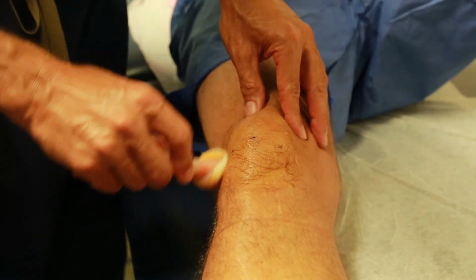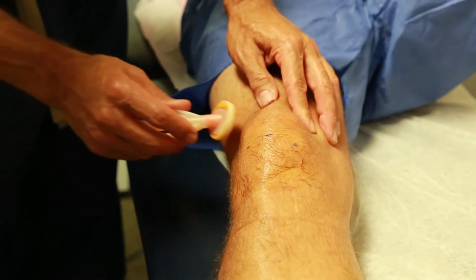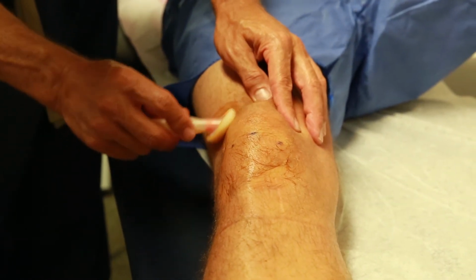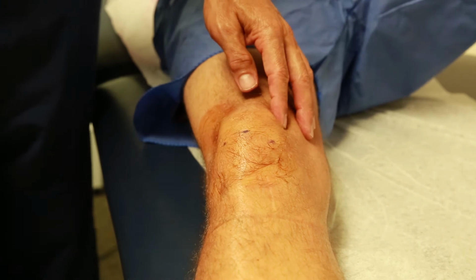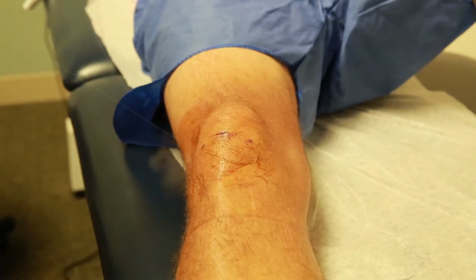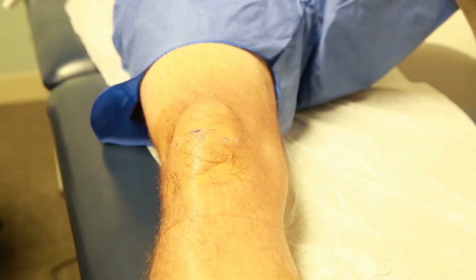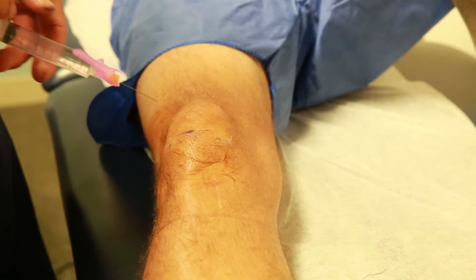that we're going to go into. Now, oftentimes we'll go superior laterally. We'll sterilize this as well if we need to see the patellofemoral joint. And then once we do that, we will inject. We often will spray just to help a little bit of the pain. This is just regular, 0.5% Lido with epi.